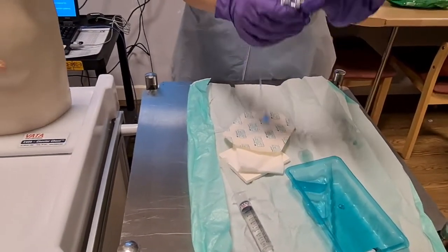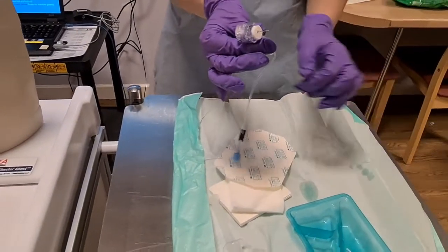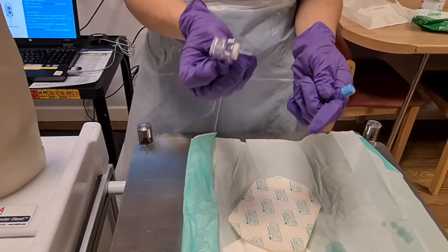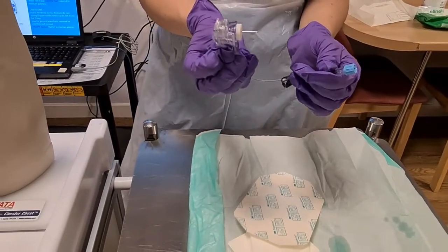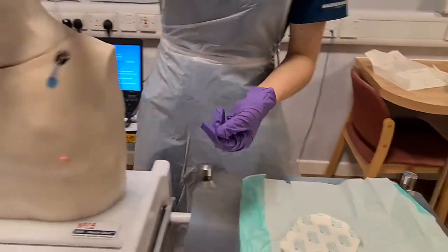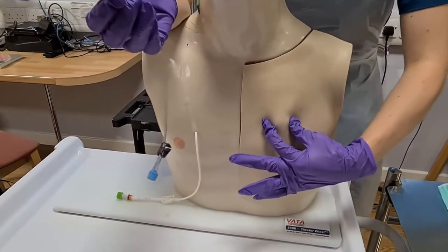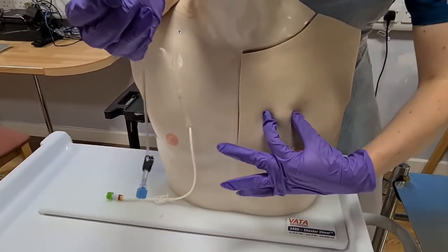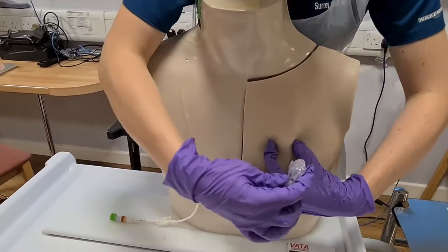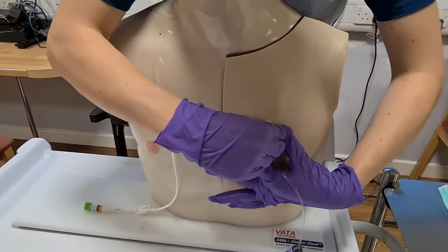Right, remove that bit of plastic. And that is your needle. So this is going to go directly in the middle of my implanted port, at a 90-degree angle directly in. I'm now going to palpate the implanted port. Index finger on one side, thumb on the other, so that I know I'm going to go in the middle. So I'm going to warn the patient and go directly in.